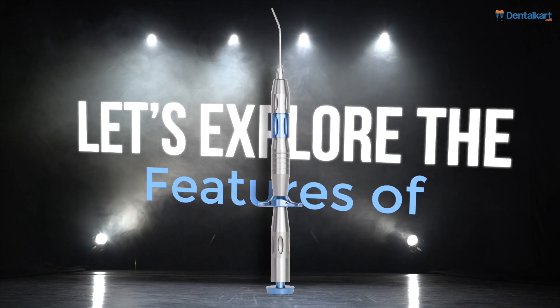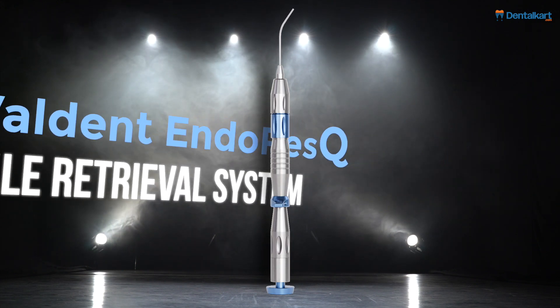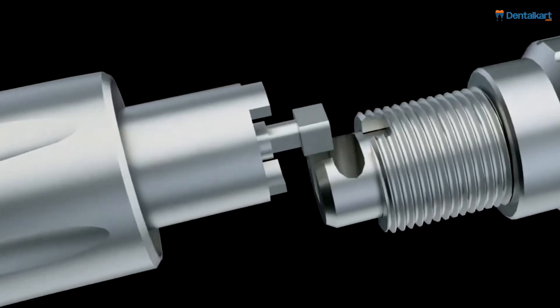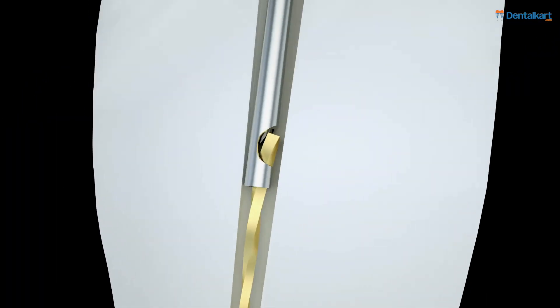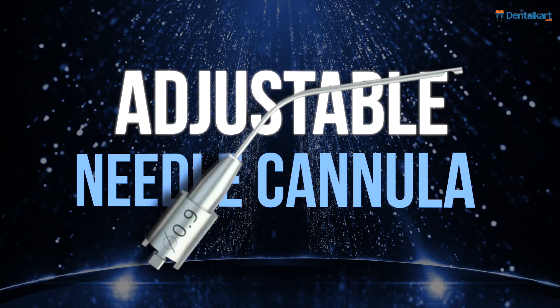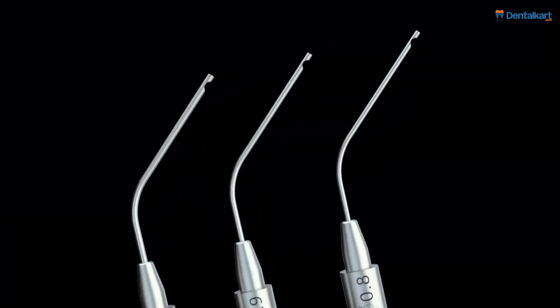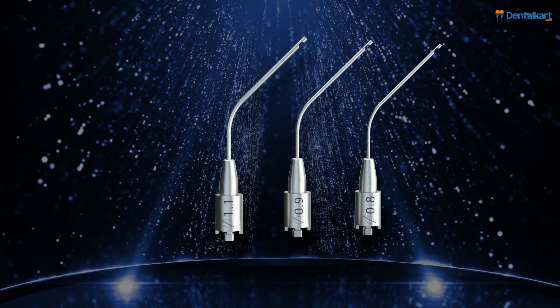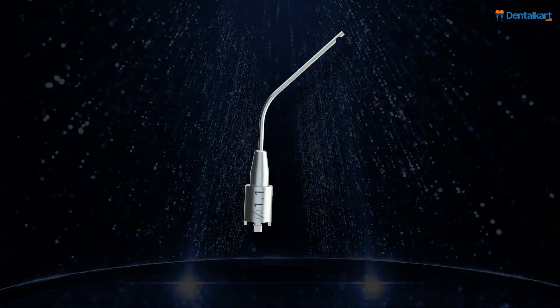Let's explore the features of the Walden EndoRescue File Retrieval System. Efficient file removal utilizes a push cap mechanism for precise clamping and extraction of broken root canal files. The adjustable needle cannula can be bent from a preset 45 degrees up to 90 degrees, providing flexibility to suit various clinical scenarios.